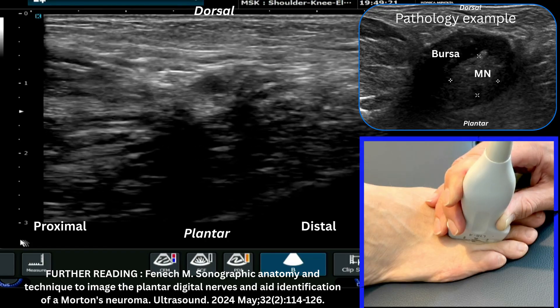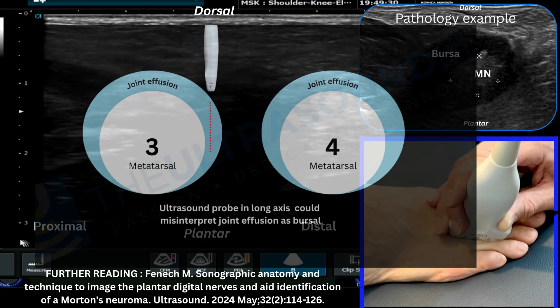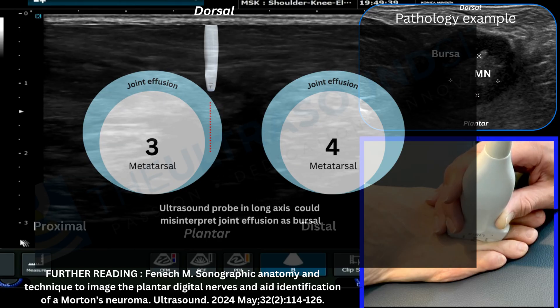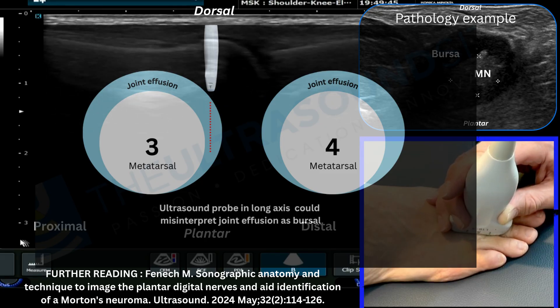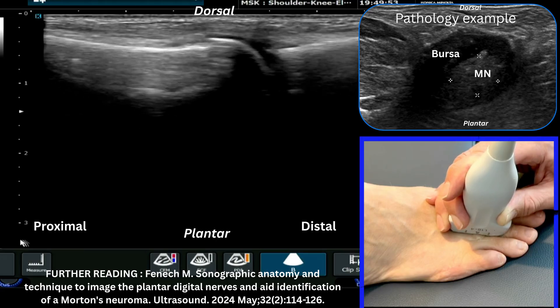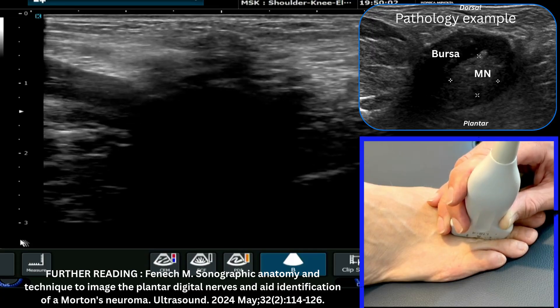Be mindful of a pitfall here: if you have an effusion of the metatarsophalangeal joint, it can run slightly across into the webspace and give you a potential false positive — an anechoic or dark compressible fluid that you might mistake for a bursa. To differentiate, go short axis on the metatarsophalangeal joint and see if you can see any effusion tracking around and into the webspace. That's the basic dorsal view from the MTP joint into the webspace.